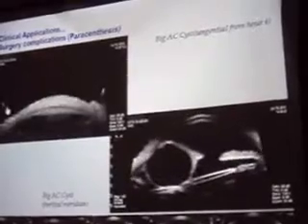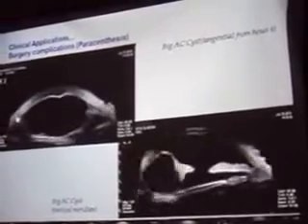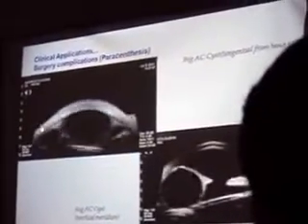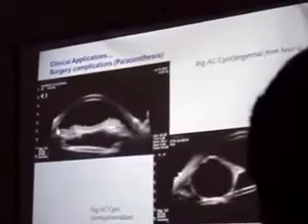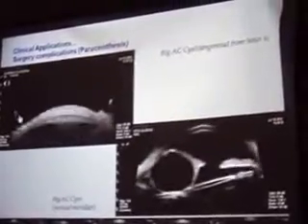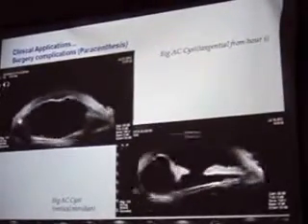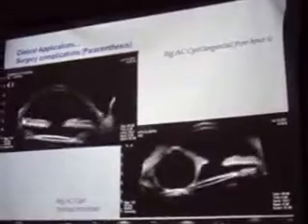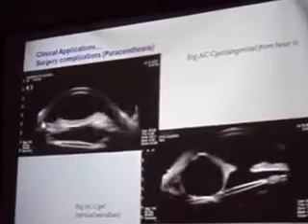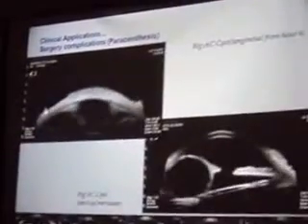There are surgical complications on standard cataract surgeries. Look at that 6. It's just miscellaneous. Of the 2 orientations of the probe, one is tangential from inferior, showing you the beginning of the anterior chamber and how the iris is interacting with the chamber. Meanwhile, at bottom right, you can see a cross-section of the cyst, bringing you an idea how much this cyst is impacting the volume of the anterior chamber.